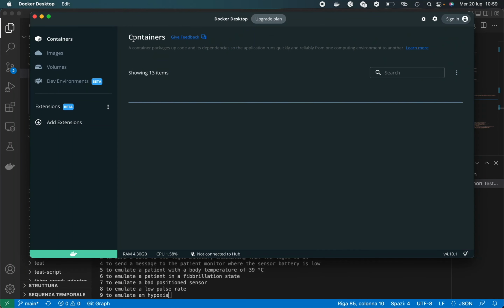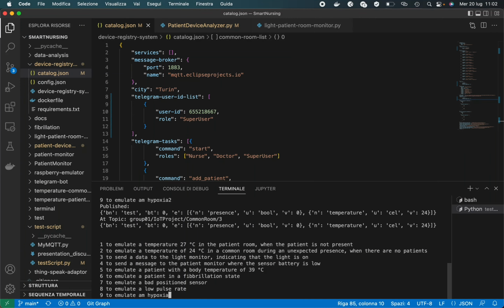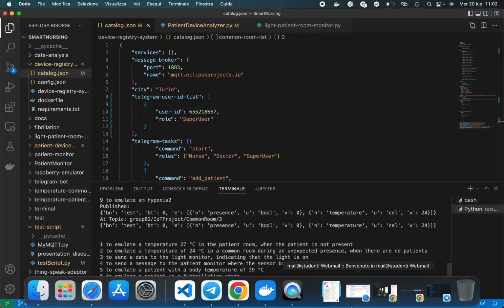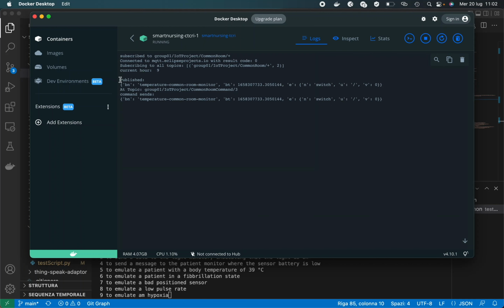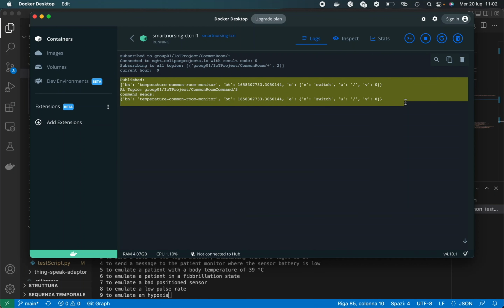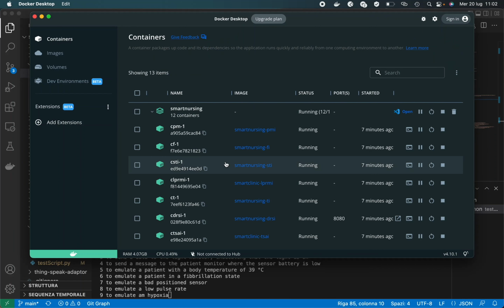Now I will press 2. I will emulate a temperature of 24 degrees for the common room during summer without patients. The container will send to the Raspberry an actuation command indicating to put the air conditioning off, because even if the desired temperature is lower than the current temperature, there are no patients in the room, so the system will keep the temperature higher than 24.